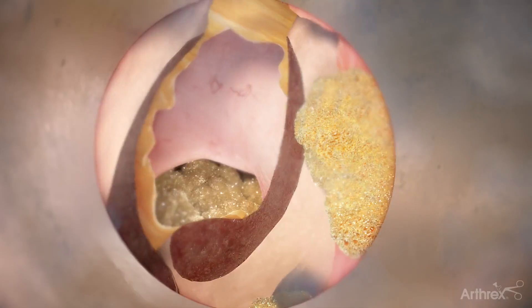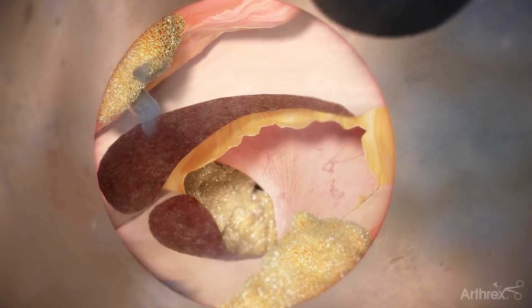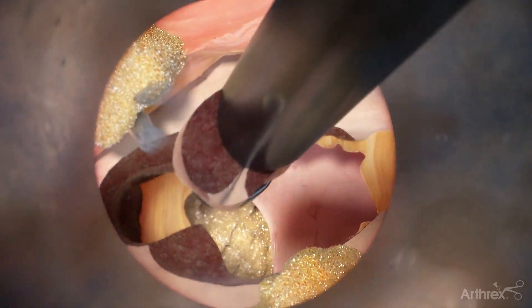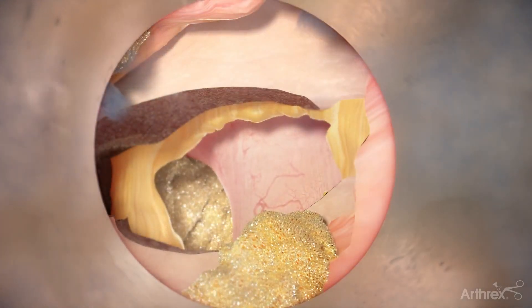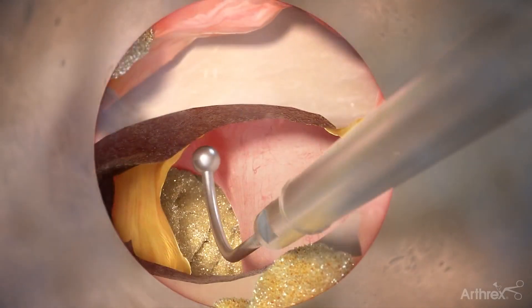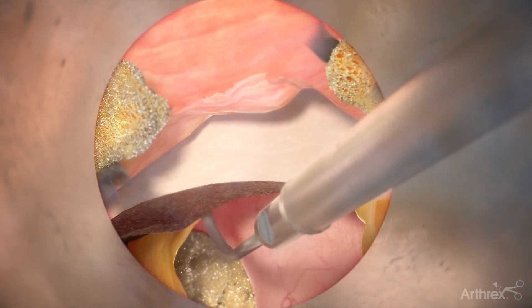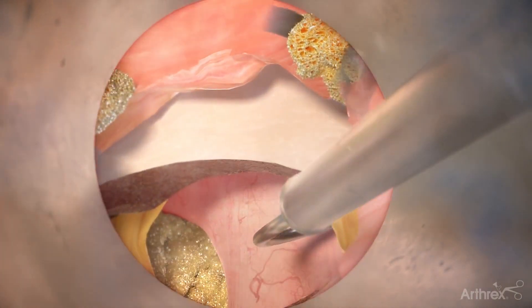The endoscope and cannula can be rotated 90 degrees to visualize the foramen and nerve to confirm that decompression is complete. Use a ball tip probe to palpate the pedicle and foramen and confirm a complete decompression via a lateral view.